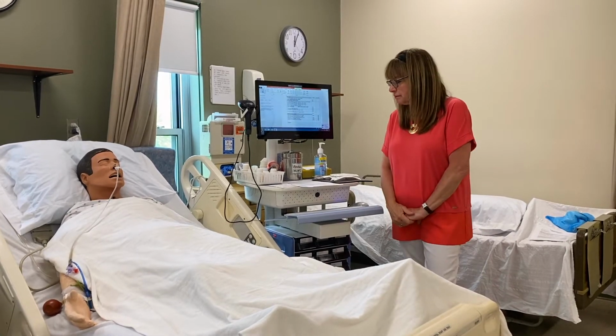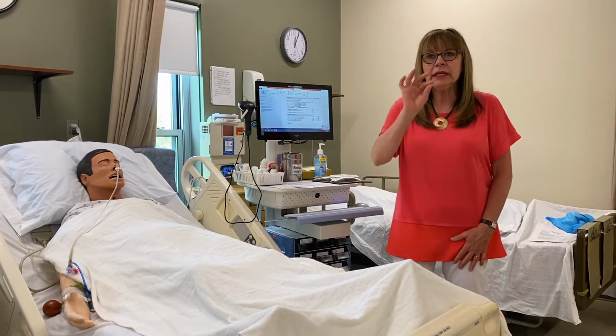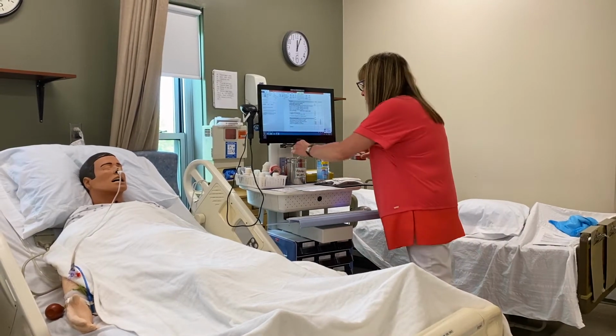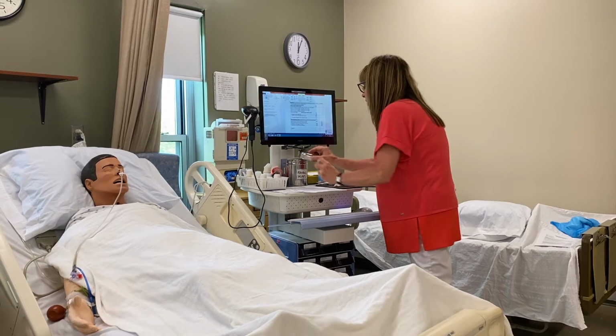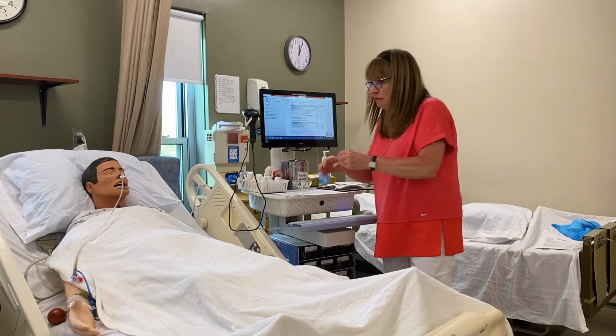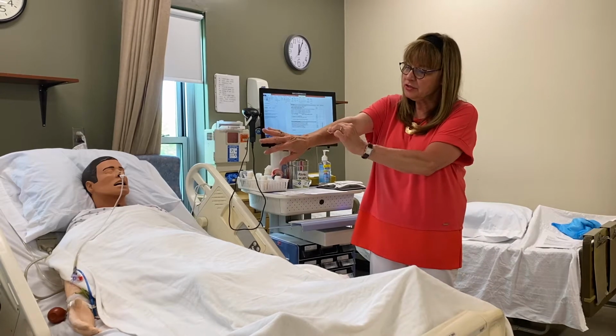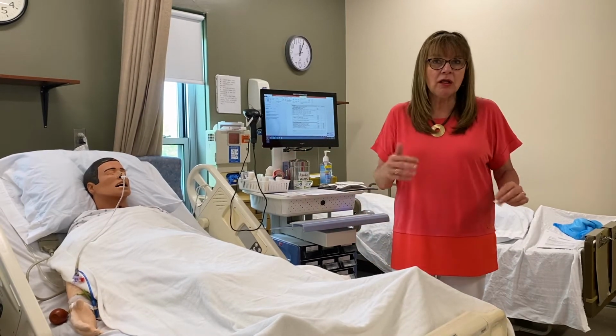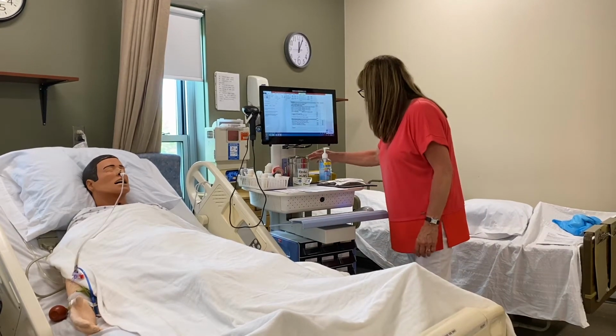person an injection. Remember that when you're cleaning the injection site, you need to take an alcohol wipe and make the site as aseptic as possible, cleaning from the center outward, 2 to 3 inches, to clean all that transient bacteria off the skin.